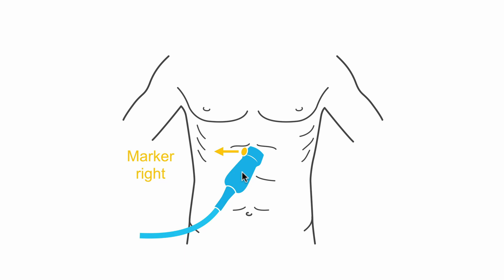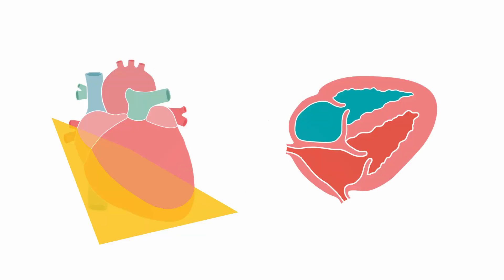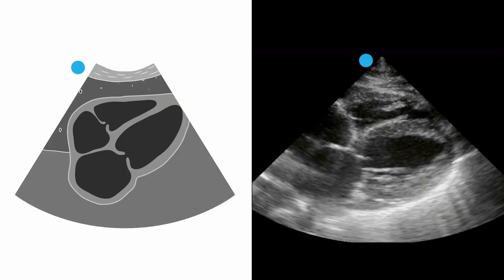You should be able to identify your heart. This is the orientation you will see: right ventricle, left ventricle, mitral valve, left atria, right atria, and your tricuspid valve. Here's what it will look like on ultrasound: right and left ventricles on the top, mitral valve, your left atria, your right atria, and your tricuspid valve.